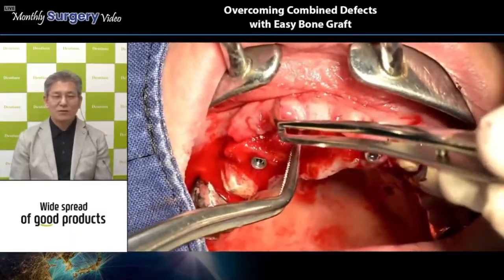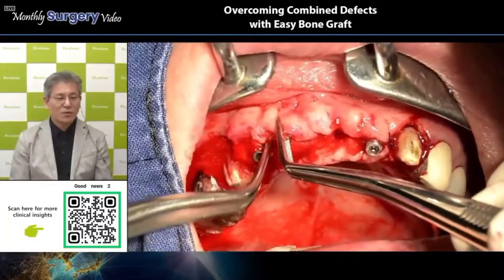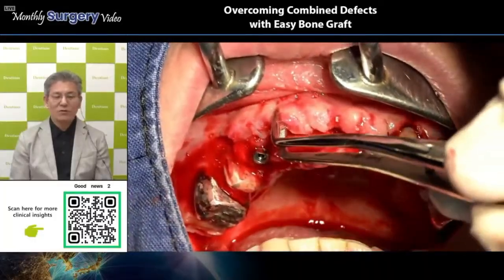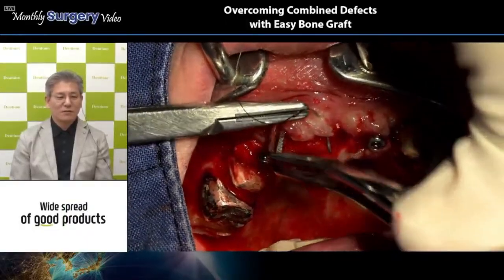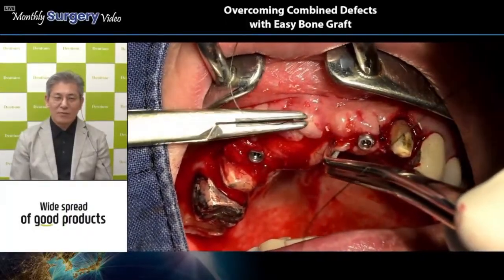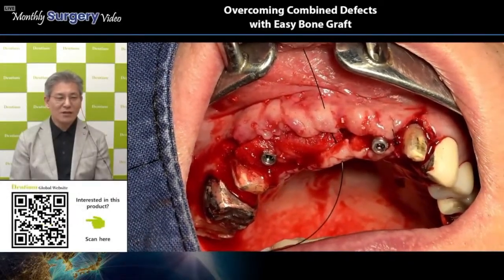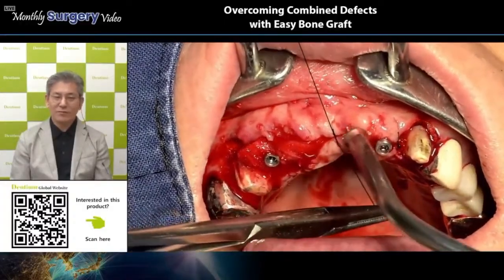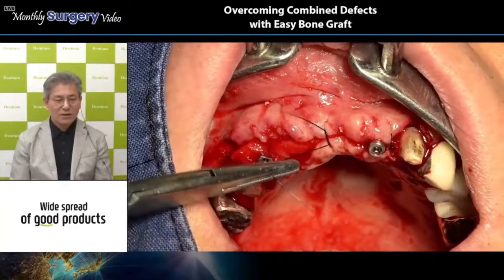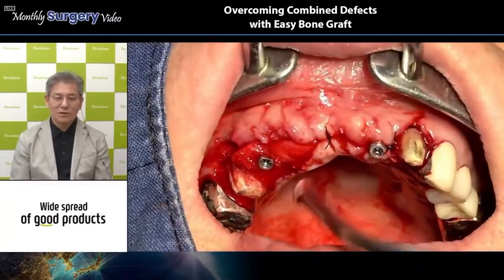This easy bone grafting concept is composed of bone graft material with a collagen graft. However, let's see, is this collagen graft enough to have a barrier function compared to a barrier membrane? Actually, that is the question. First, the resorption time.